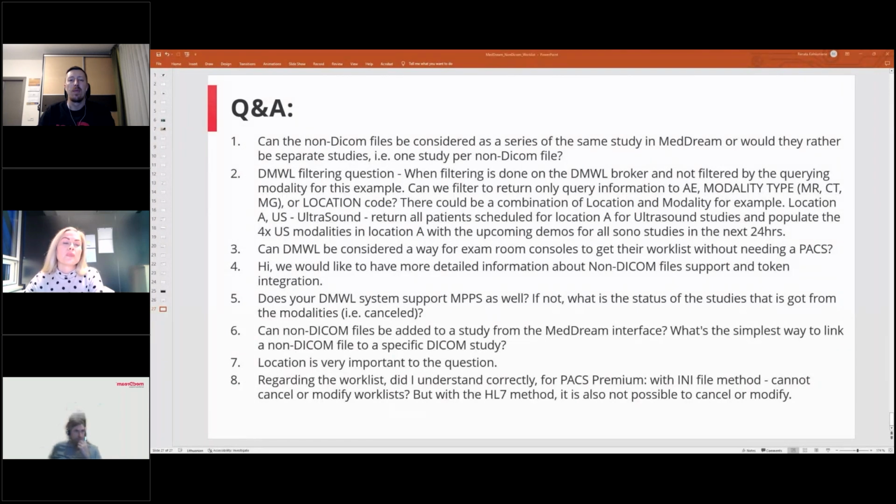Okay, thank you. And I see it's the last question. So if somebody wants to ask something, please write now. I'm going to read the last question.